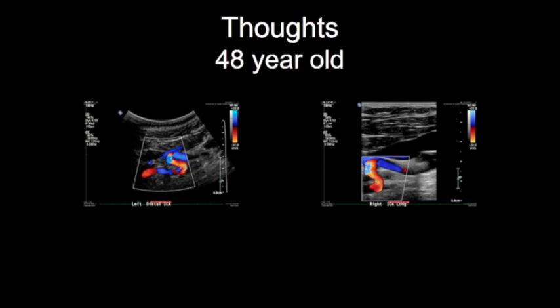Now, next case, the case of the meandering vessel. This is a patient who has sigmoid ICAs. The proximal ICAs are not in either of these pictures. This is kind of the mid to distal ICAs. Okay, so that's the first piece of information.